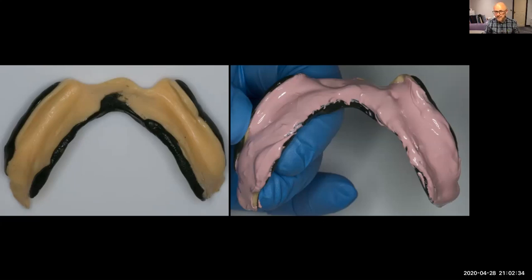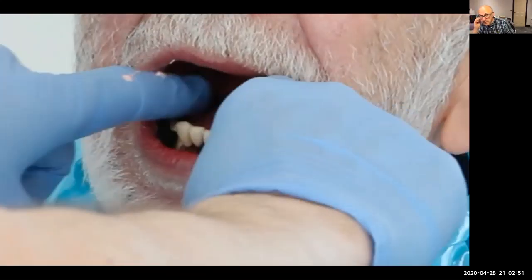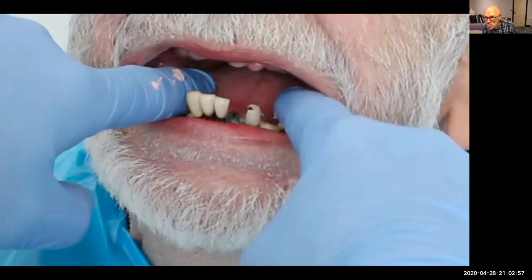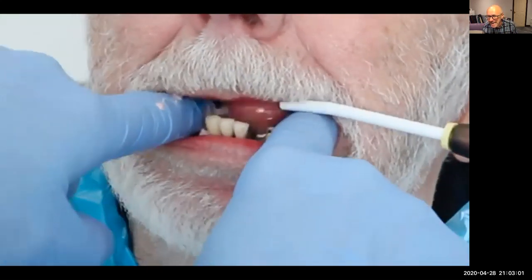And then I put zinc oxide on and do the same movements. So we take this to the mouth. Here is Bert. So I'm going to take this out, and here we go. So I push that down firmly and get him to go ooh. That's first. Lick the upper lip, 3.